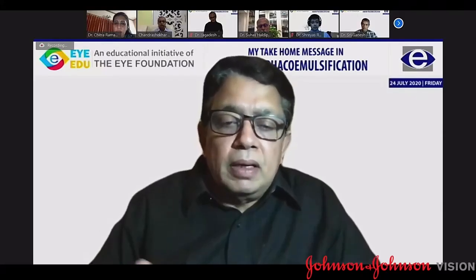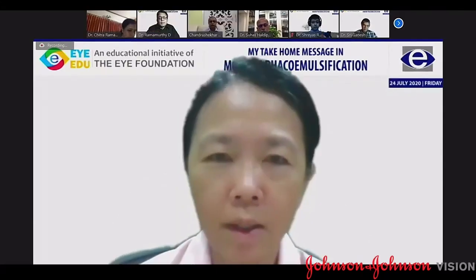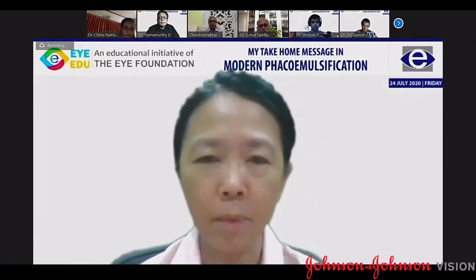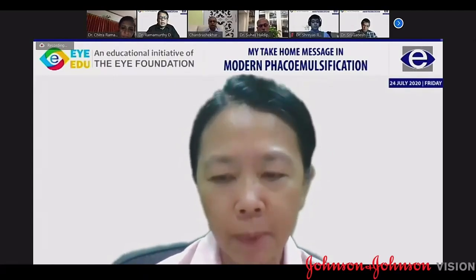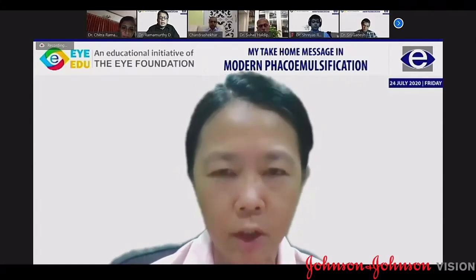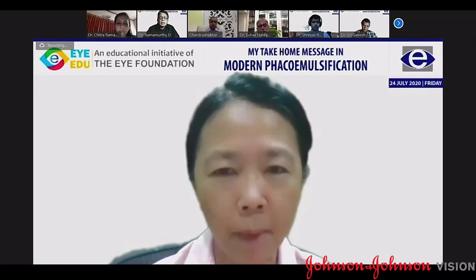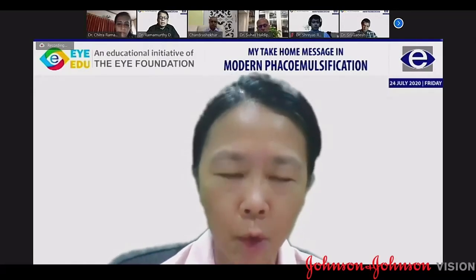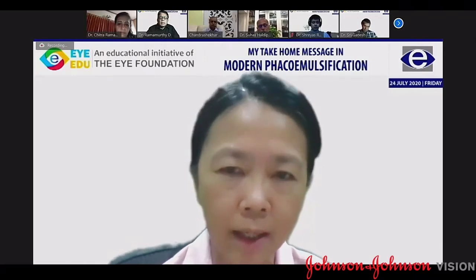Your comments, I mean, in your clinic, what do you do to achieve this day in and day out on your regular patients? Yeah, so I think he's covered most of the major points that I would take care to ensure that they're covered. So for example, if a patient comes in and identifies himself as wanting to have cataract surgery done by me, then even before I see him, I actually send him for biometry, because I think doing biometry and acquiring data in an untouched eye is very important.